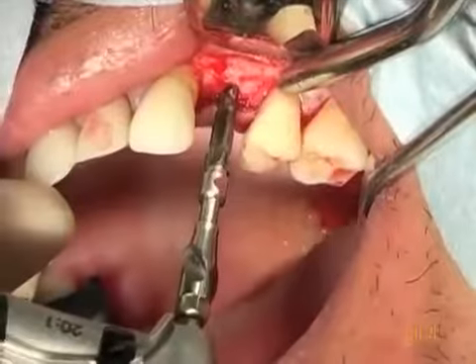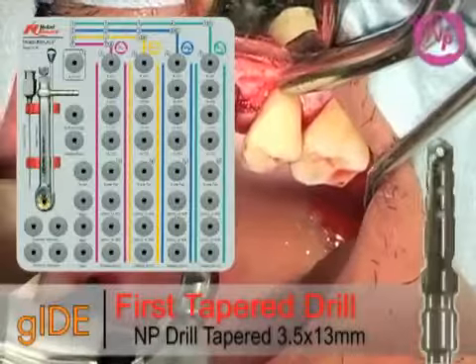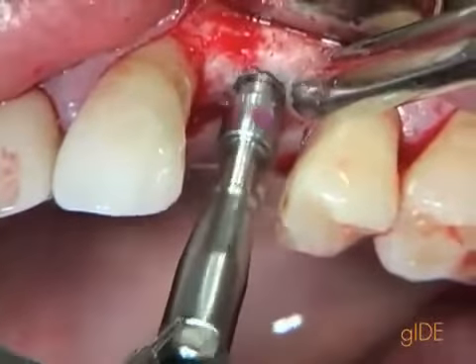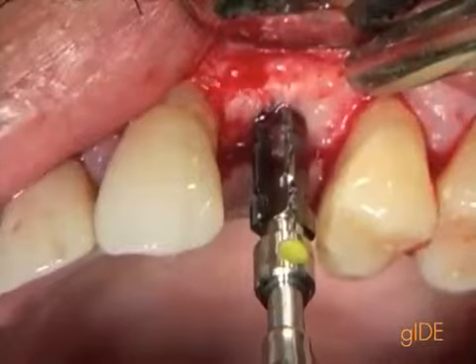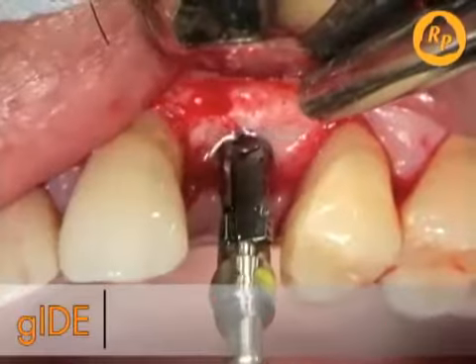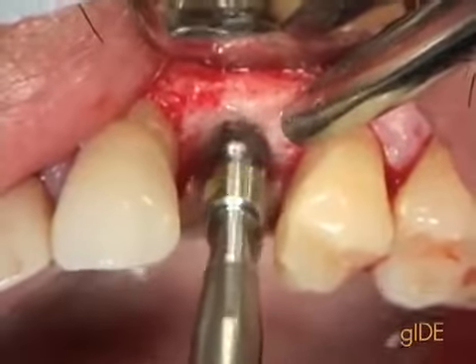The next drill is a narrow platform taper drill, 3.5 by 13, which is guided into position to final depth, where you can see here the final depth of this to be 13 millimeters for the next implant placement. The regular platform taper drill used here is a 13 millimeter, which is guided into final position, again at the crest of bone.